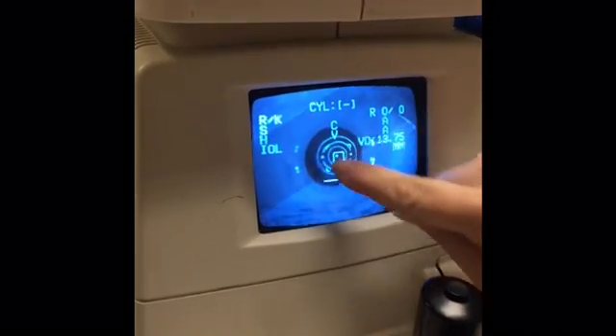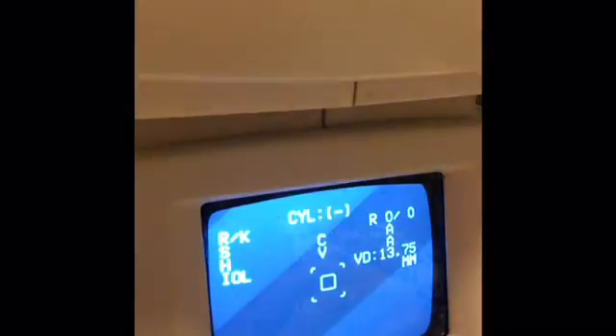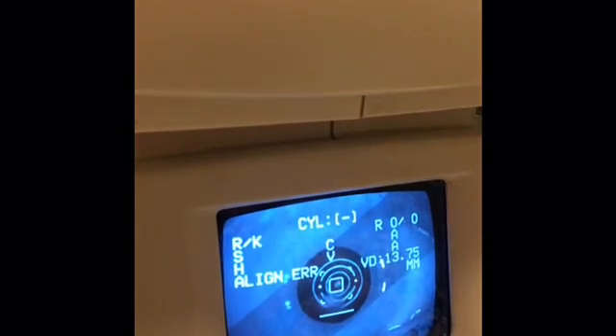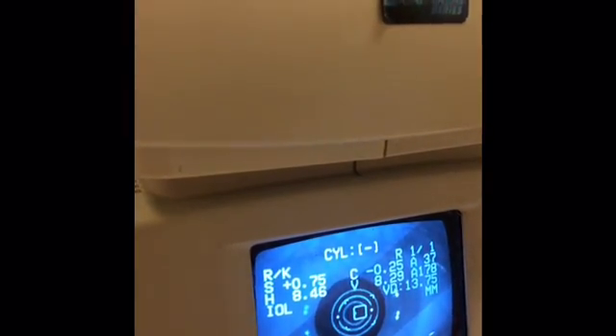Notice the mires — the concentric circles. You want these to be as sharp and clear as possible. When the mires are clear, many ARs will automatically begin to take the measurement. If the mires are clear but the instrument does not automatically begin to take the measurement, you can press the trigger button on top of the joystick.